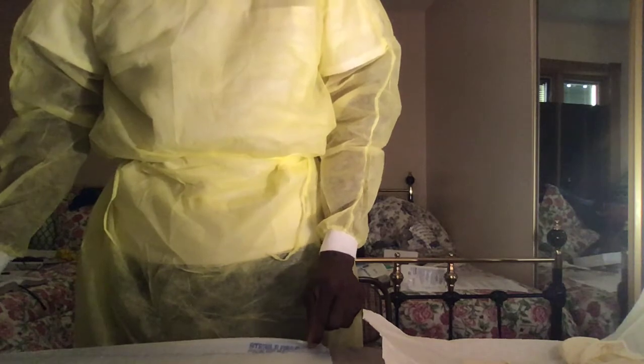Next thing I'm going to do is set up my sterile field. When I open this, I open it away from me with one flap. I handle the edges. And this is my clean field. I'd opened my package. These are the supplies I'm going to use.